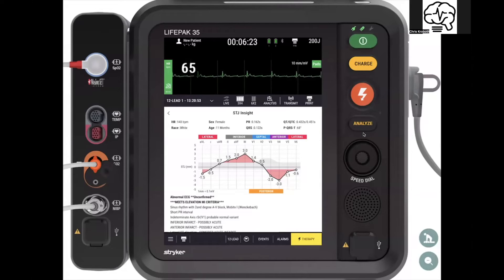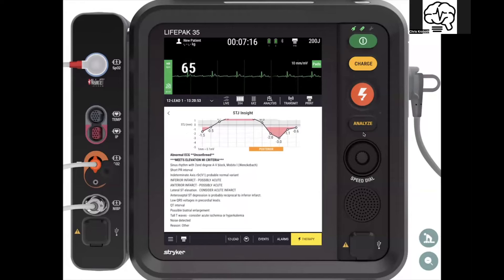At two o'clock in the morning, this is going to help the provider not fail — it's the thing that's going to make you check it one more time. Or if you have a BLS crew with really long transport times who get this statement and call in a STEMI alert, they can actually give the mapping of what's changing on the monitor. You also now have a much more specific way of measuring those changes as you trend the patient from first contact through transfer of care, so you can see if the disease process is progressing, stalled, or improving. STJ Insight gives you that mapping plus the traditional Glasgow statement as well.